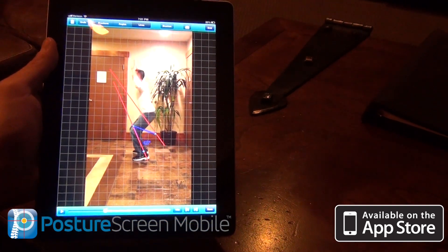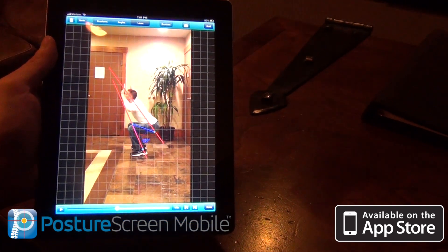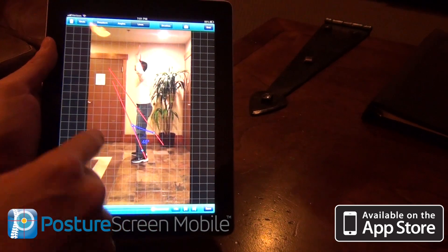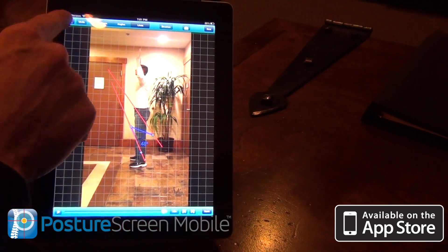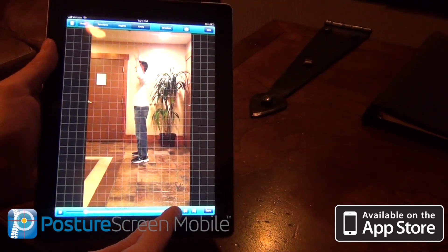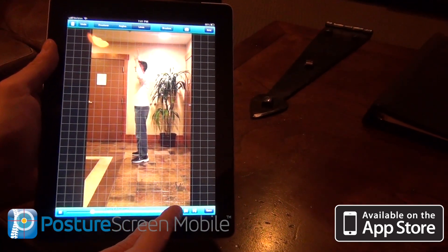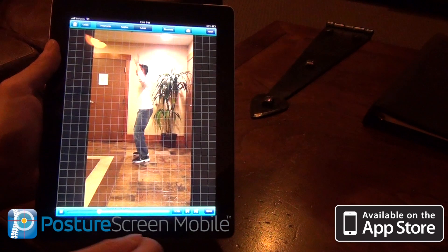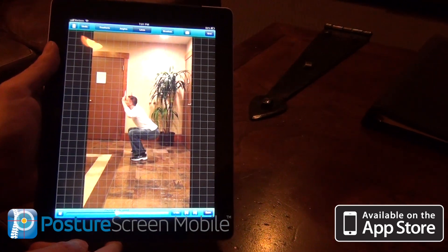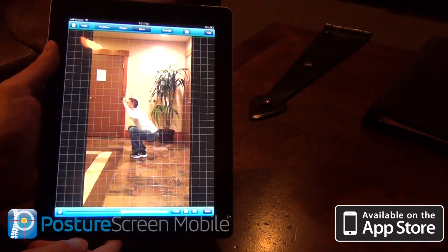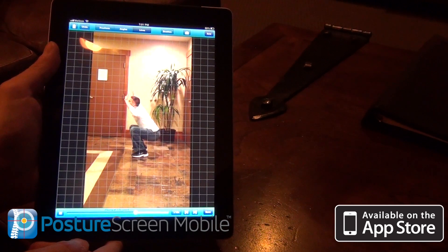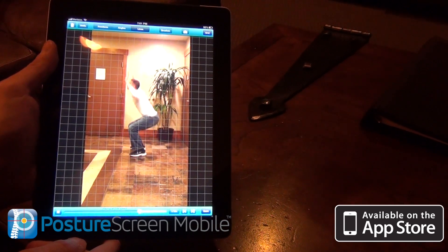Now if I wanted to just go ahead and play this, I could play this down. I'm going to turn down the volume so you don't hear me coaching the patient. You'll see how he squats down and comes back up. And let's go ahead and slow this down - I can do it at 1/16th of speed.